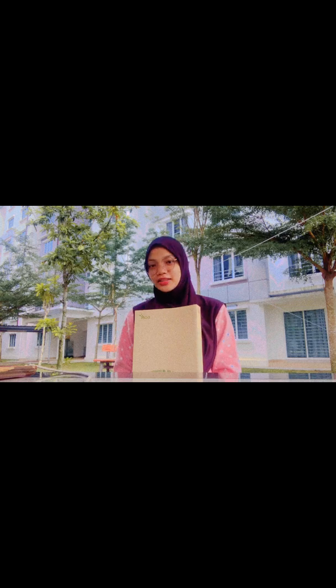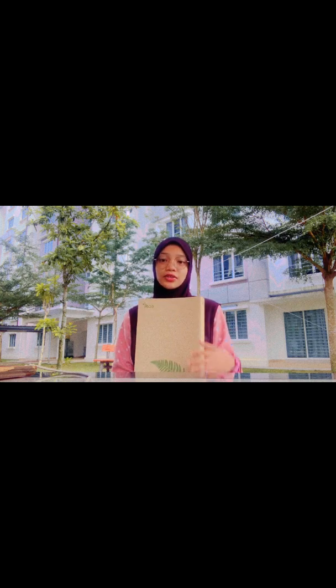For the cassette size, we're going to use 35 times 43 centimeter, which is the largest cassette size. For the orientation, lengthwise or crosswise, it depends on the patient's body habitus. Secondly, the kVp we're going to use ranges from 60 to 80, and the mAs is 10 to 20. For the SID, we're going to use 100 centimeter for recumbent position and 180 centimeter for the erect position. Grid is used in evaluating PA ribs.